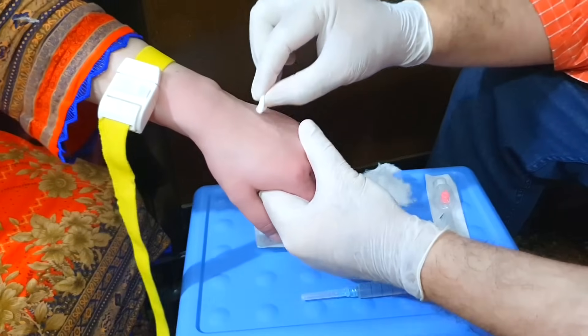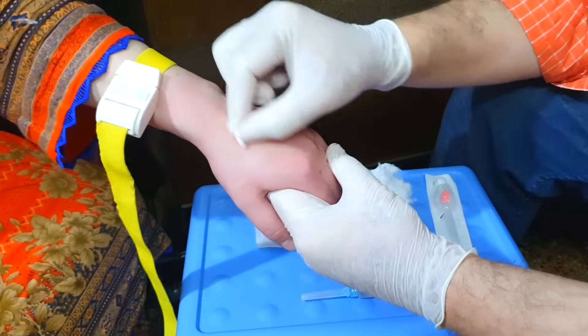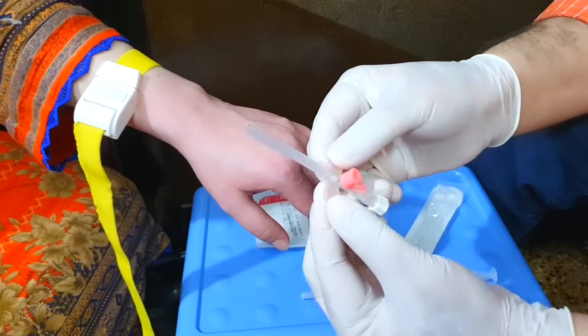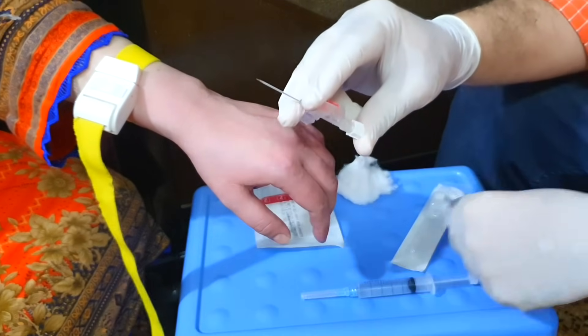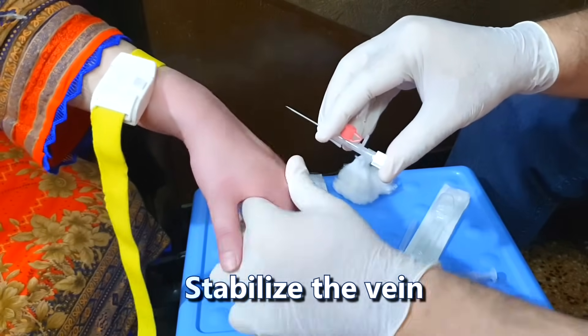Apply an alcohol swab on the area in a circular motion, moving from inside towards outside. Let the area dry. Meanwhile, open the IV cannula from its package, make its wings straight, and hold it like this. Remove the protective cover of the IV cannula.